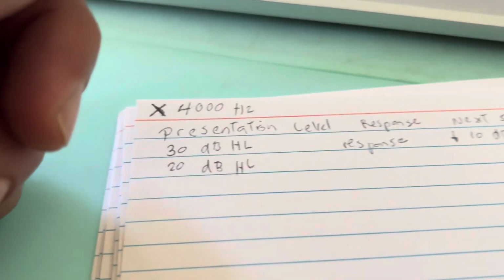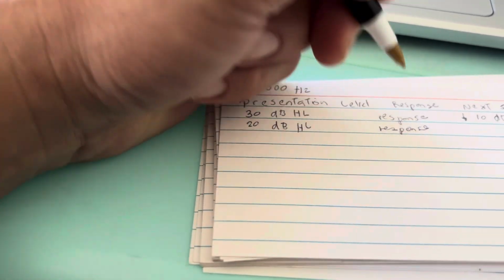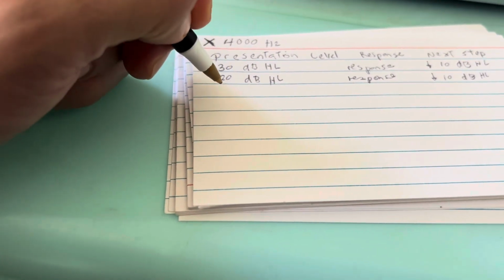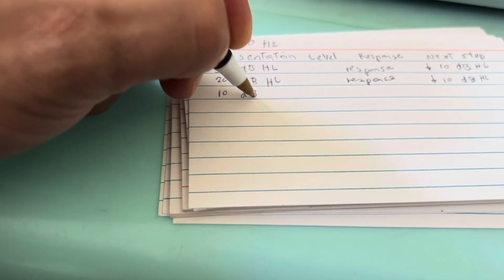So there was a response by the person, which means we have to go down another 10 decibels hearing level. Since there was a response, that will make it 10 decibel hearing level.